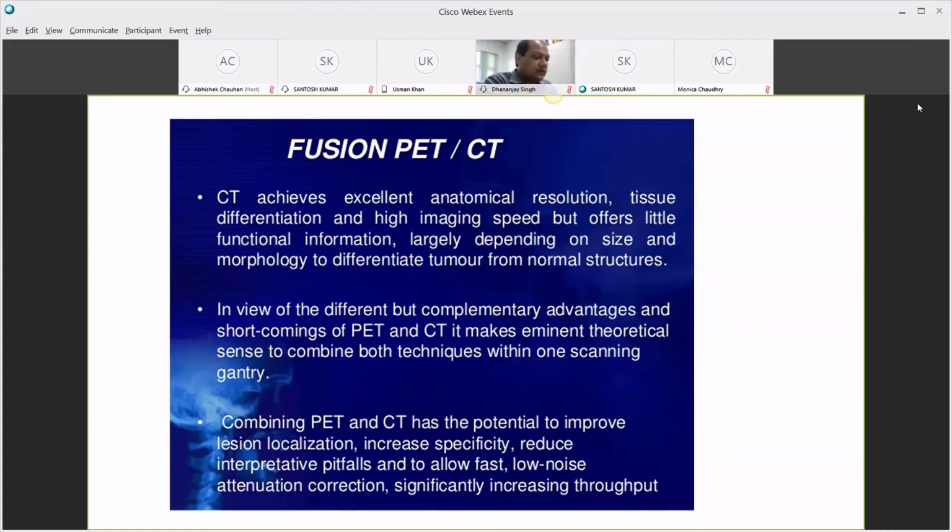or MRI with nuclear medicine. So there are solutions available, and there are certain companies like GE, Siemens, Philips. There is different software called multimodality registration. GE calls it integrated registration.